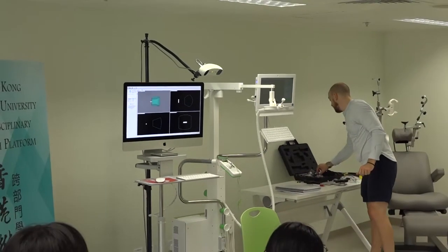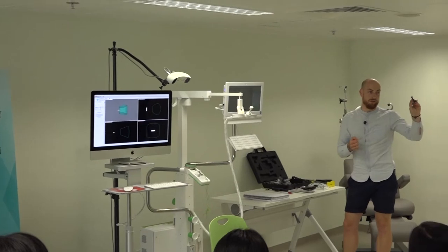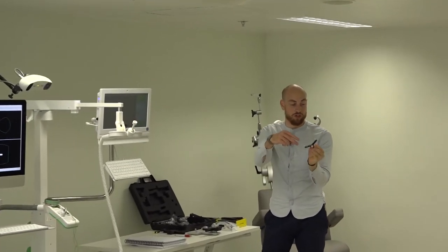Now the Polaris is going to be looking for these reflective spheres. It's quite important that you don't touch these reflective spheres, because the natural oil on your hands will block the reflectiveness. And if they're scratched, they just come up as dead points, so the camera won't be able to find them. If you do accidentally touch them, you can clean them with the alcohol wipes and take that oil off, because sometimes you will accidentally touch them. If they are scratched, you do have spares. With a pair of latex gloves, you can just pull them off and pop a new one on there.